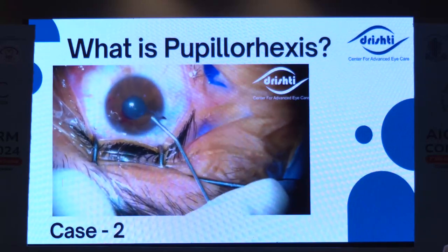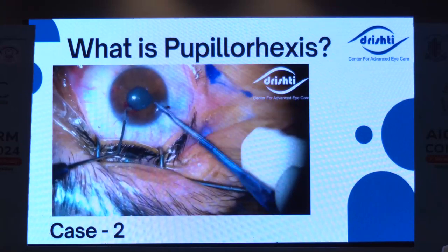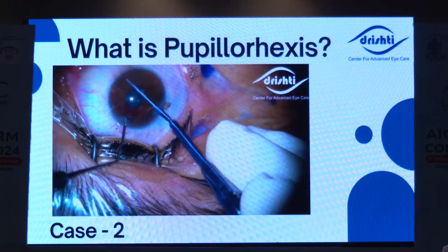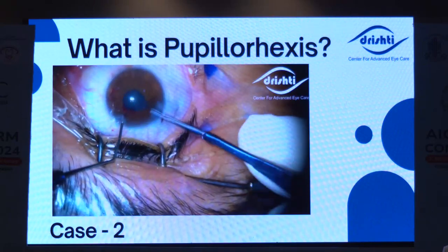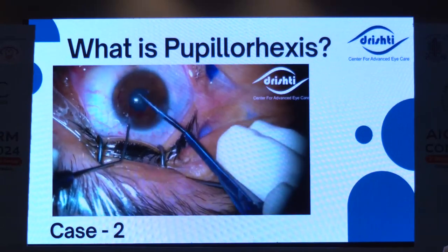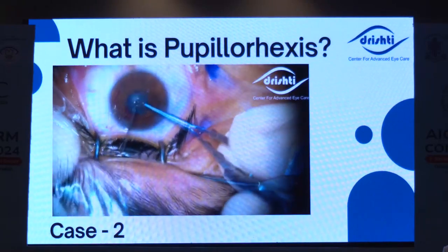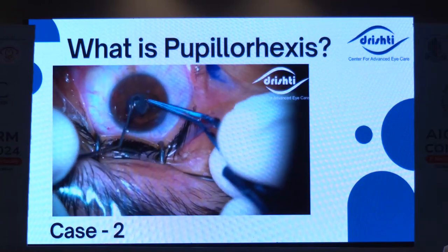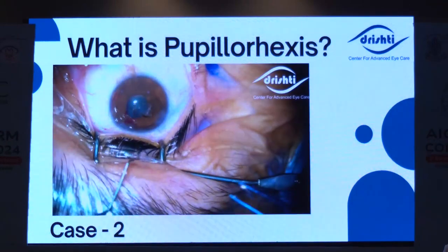These kinds of pupils usually dilate and respond very well to pupillary dilatation, to adrenaline. And here the intact membrane is removed from the iris. The membrane usually comes off in toto, but sometimes it breaks, and you can get a complete rhexis done.